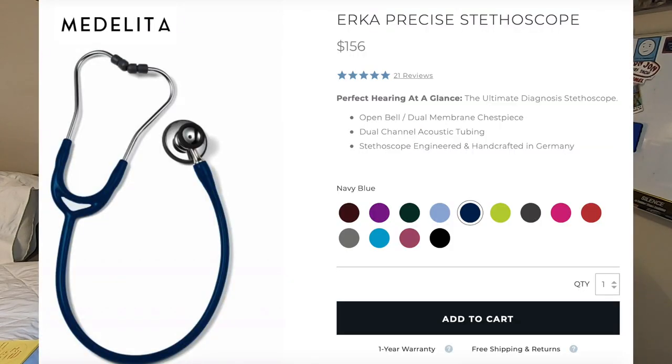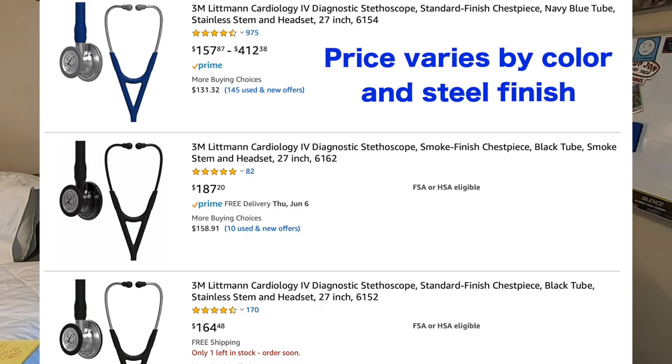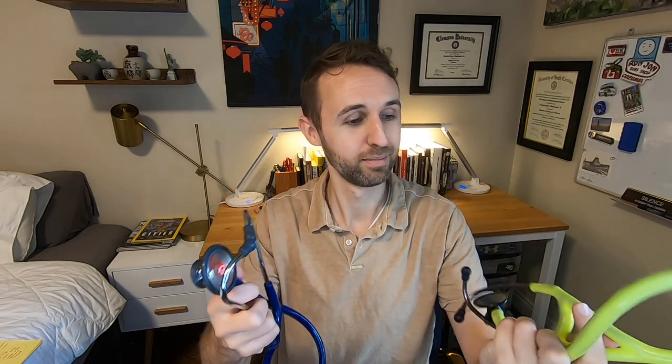The Urca that I've been using for the past two weeks is called the Urca Precise. It actually compares to the Cardiology III and IV. The Cardiology IV on the Lippmann side is what replaced the III — basically the same make and finish, though they say they've amplified the quality of sound in the Cardiology IV. Anyway, the Urca Precise is supposed to compare to the Cardiology IV. In this case, I'm going to be comparing it to the Cardiology III, because that's all I've used.